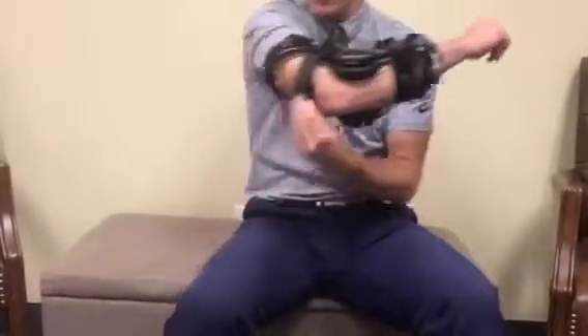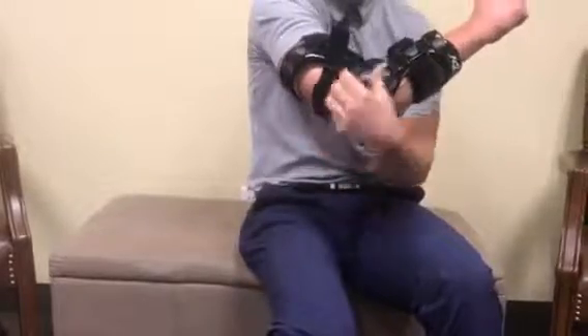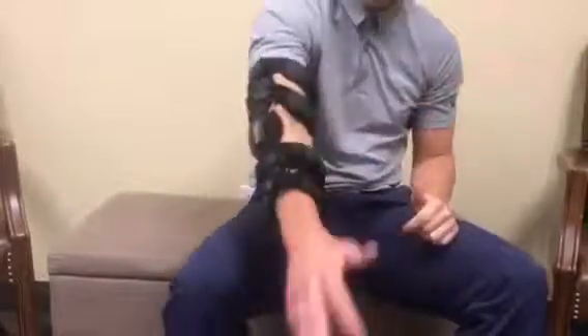You can also come down here, tighten here, and then come to the posterior strap and tighten here. I typically keep these loose initially and then tighten them on the back end. Now I'm set and ready to play.